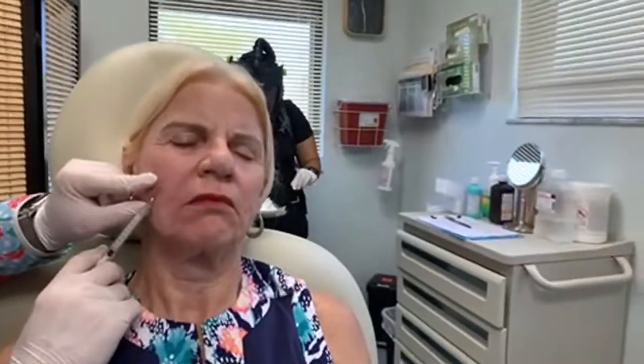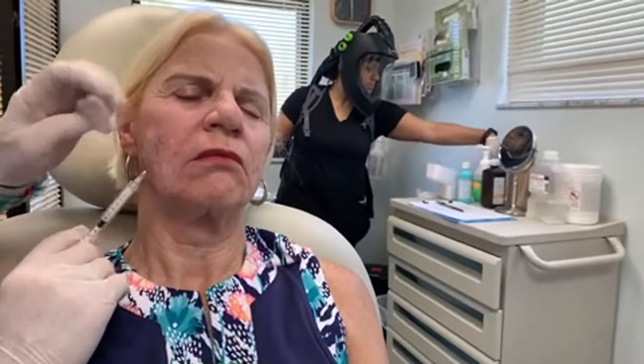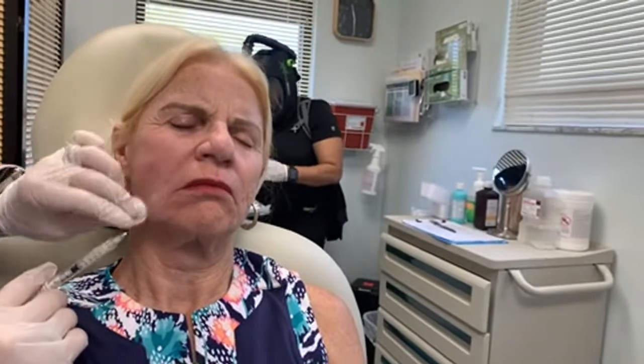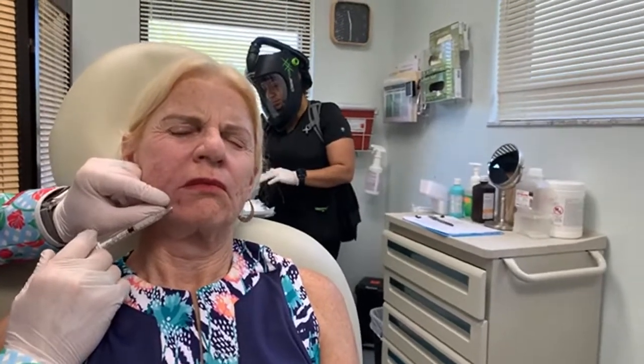That's why we say you don't want to taste the chocolate cake before it's done baking. Everything's looking good. Little pinch, 1, 2, 3, pinch. Tender. 1, 2, 3, pinch. Just chasing a few of those extra little creases.